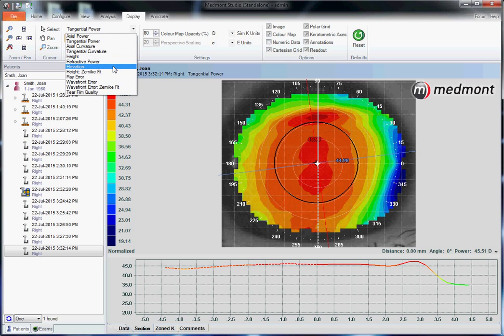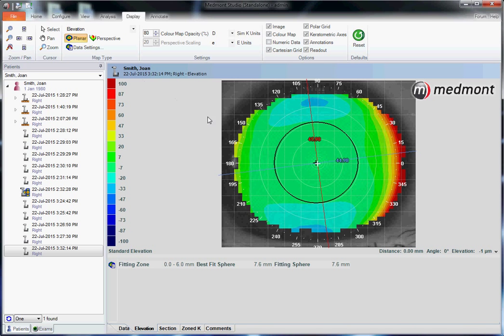We could look at the elevation of the eye and see that a rigid contact lens dropped on this eye is going to hit heaviest on the red areas, and on its opposing side it's going to lift greatest where you see blue. This is high elevation where you see hot colors and low elevation on the corneal surface where you see blue.